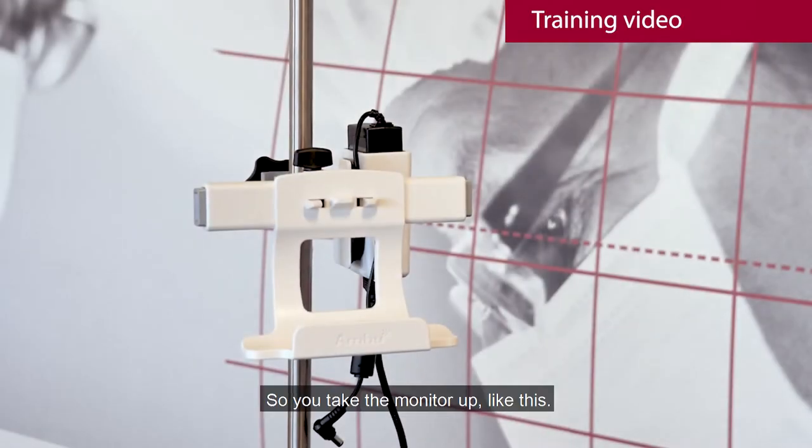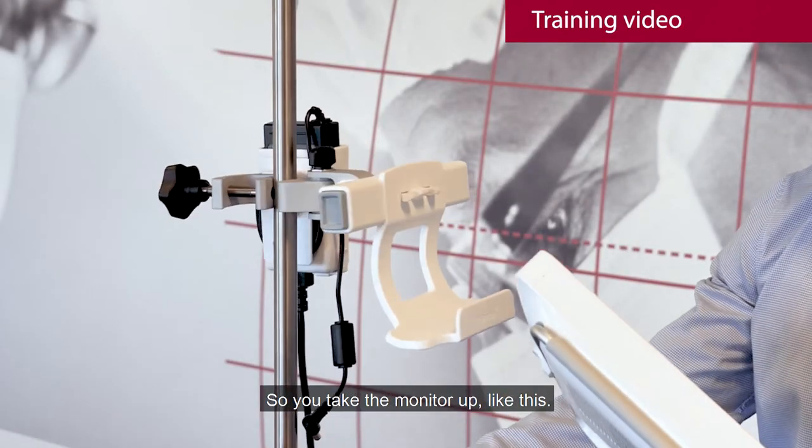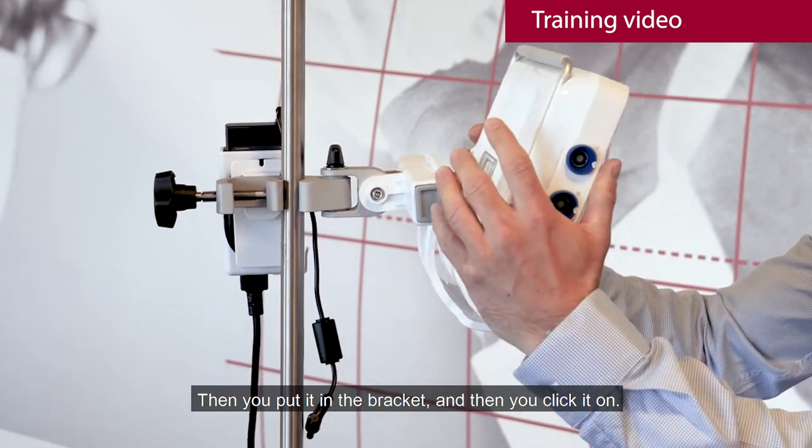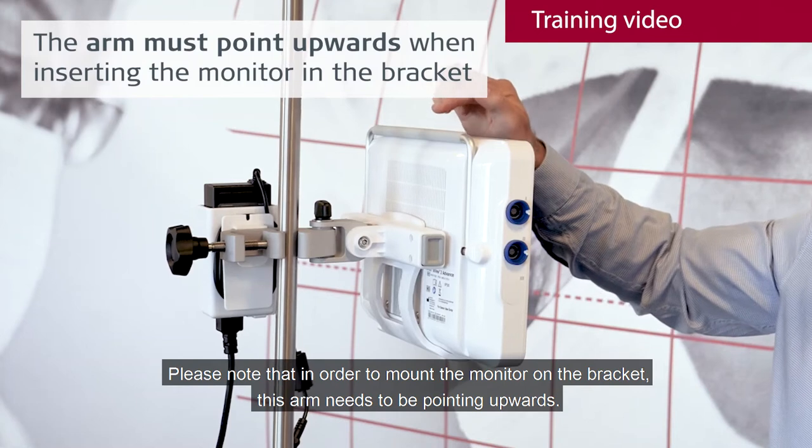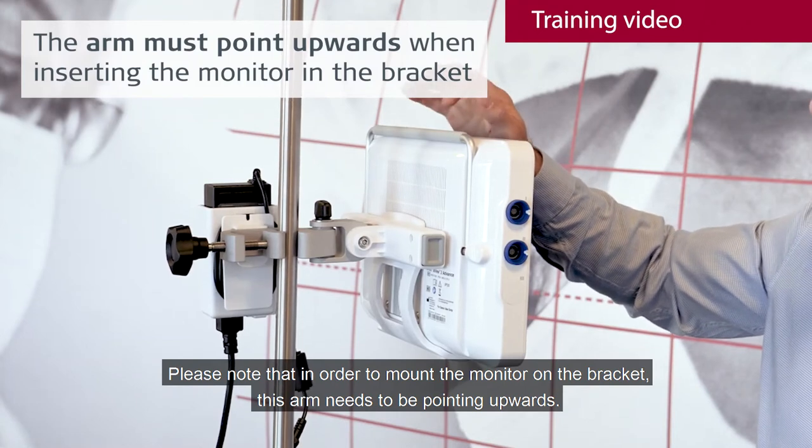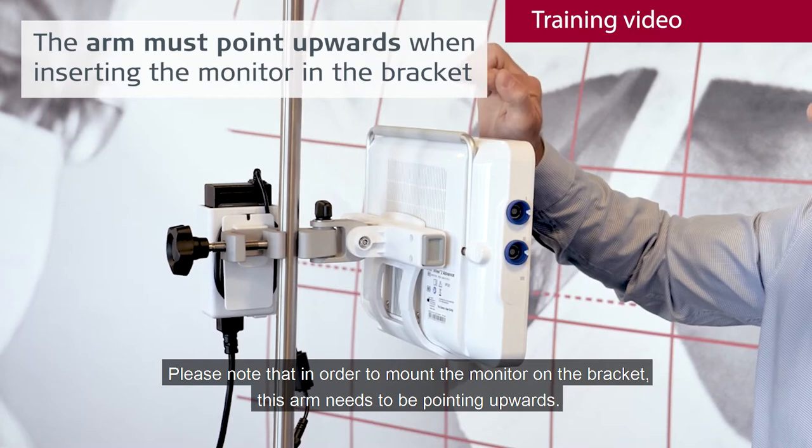So you take the monitor up like this, then you put it in the bracket and then you click it on. Please note that in order to mount the monitor on the bracket, this arm needs to be pointing upwards.